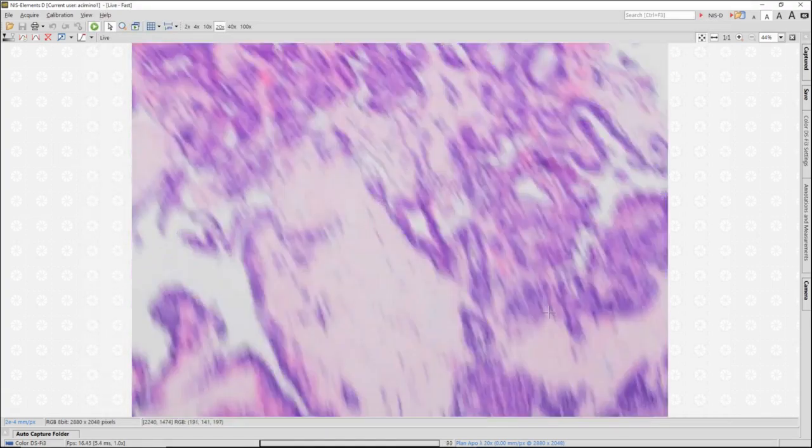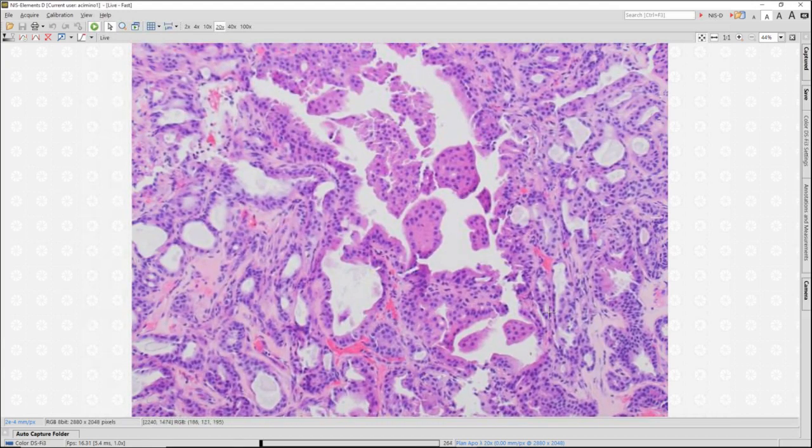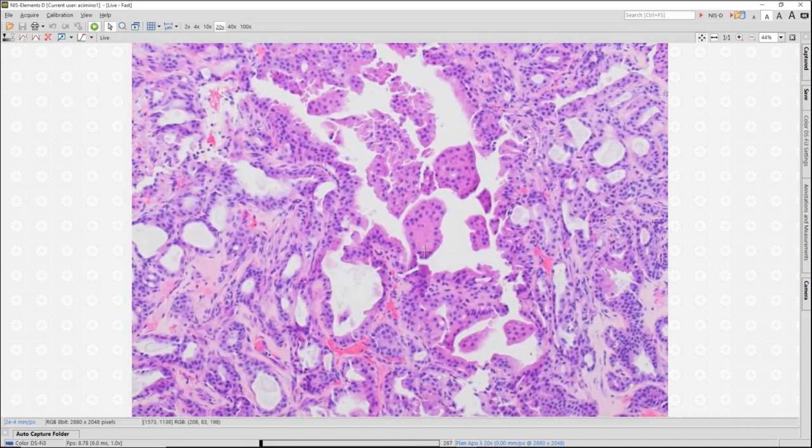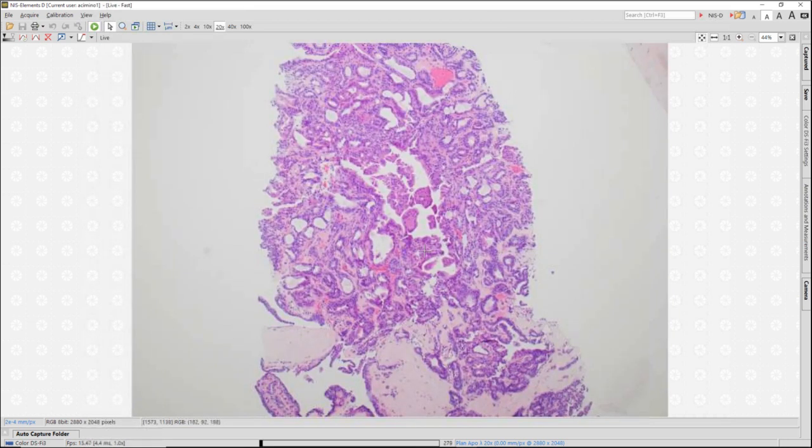As we move along this core, we see another example of the change the epithelial cells can undergo. And in this field, we see an example of apocrine metaplasia, the same type of metaplasia you see in fibrocystic changes. The lining cells of the intraductal papilloma can undergo similar changes, but the cells still maintain their normochromatic appearance, bland nuclei, and this abundant pink granular cytoplasm. So this is a nice example of an intraductal papilloma with adenosis and some apocrine metaplasia.